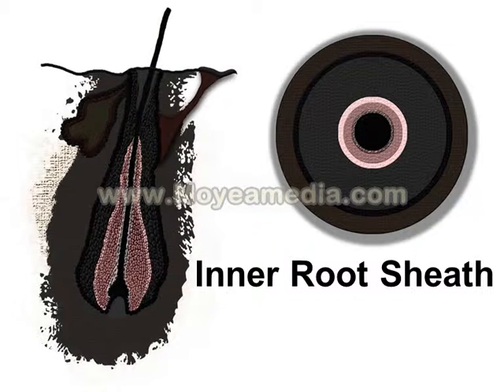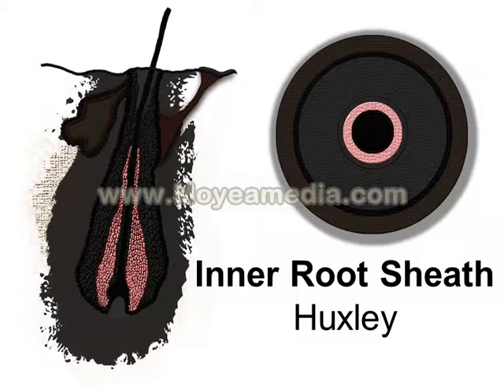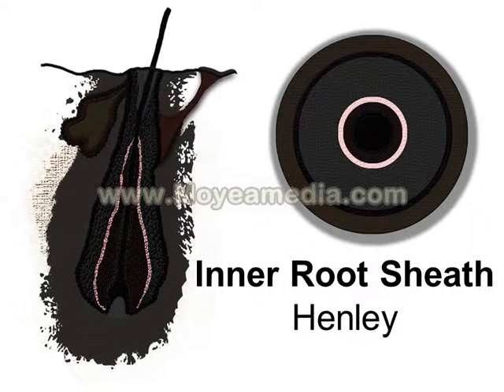The inner root sheath is composed of 3 layers. The inner root sheath cuticle is the innermost layer. Next is the Huxley layer, which is the last to keratinize, and so usually easily visible because of the bright red trichohyalin granules within it. Surrounding that is the Henle layer, easy to remember because they make the hen live outside the barn, so the Henle layer is on the outside.